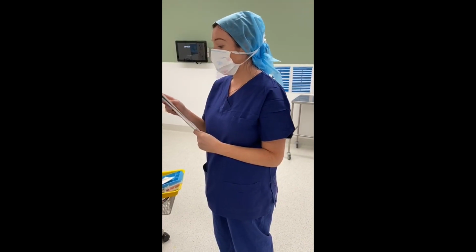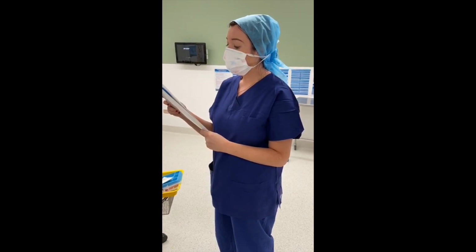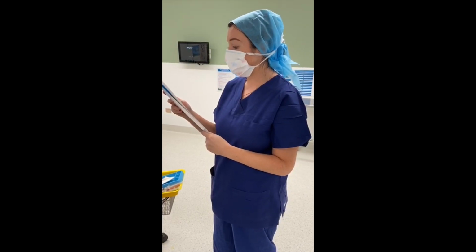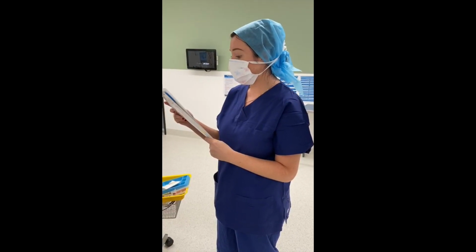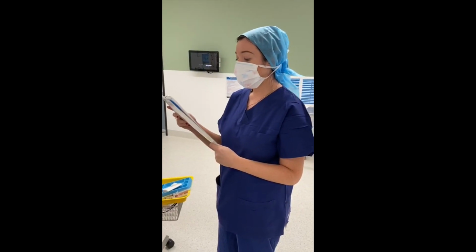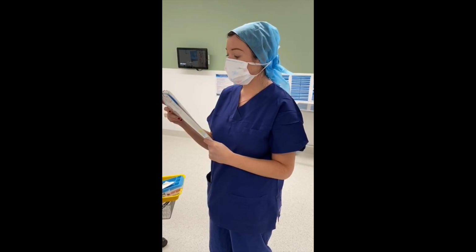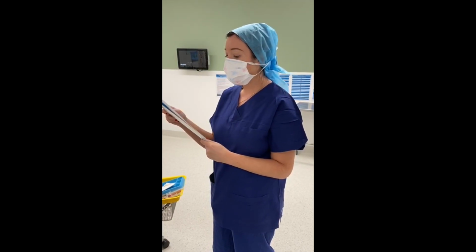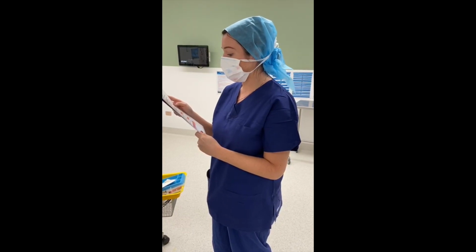I will instruct you to remove the mask, which will be discarded into the bin, leaving the filter on the circuit. I will instruct you to commence video laryngoscopy, and once intubated, the stylet or bougie will be removed. Don't forget to use the gauze, and this will be immediately placed in the bin. The cuff is then immediately inflated with 10 mils of air, and the anaesthetic nurse will announce the cuff is inflated.